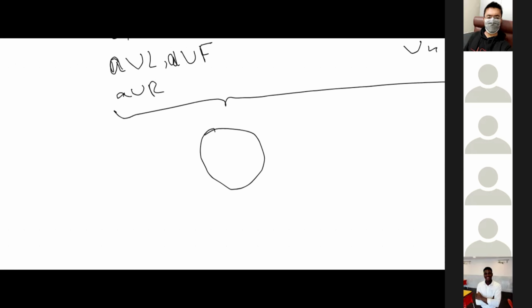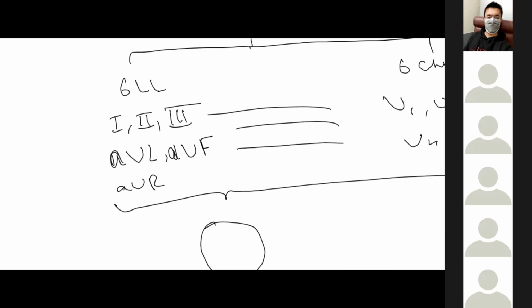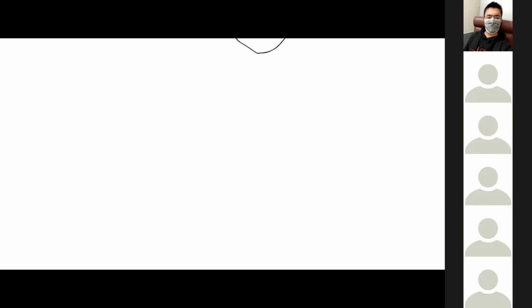To understand the pathology, we use a combination of these leads. Definitely, we are doing the ECG to understand what's going on in the heart.